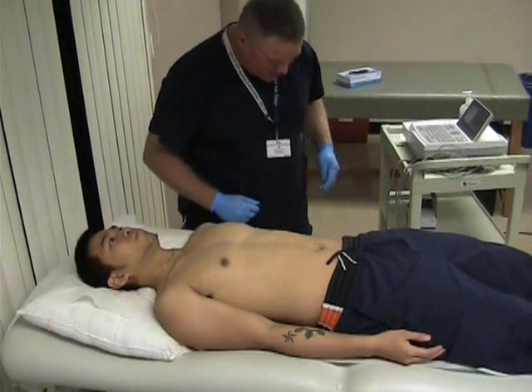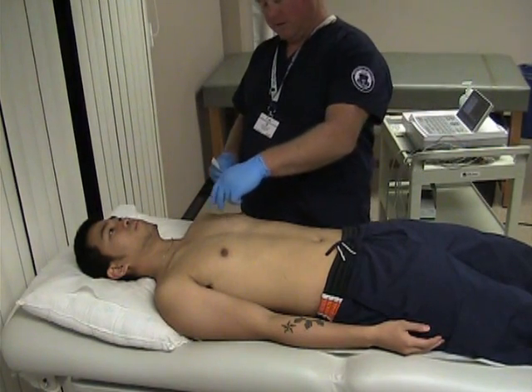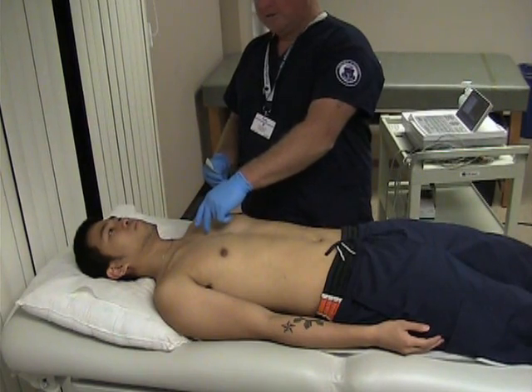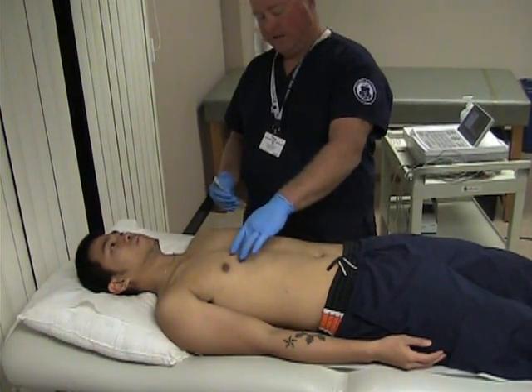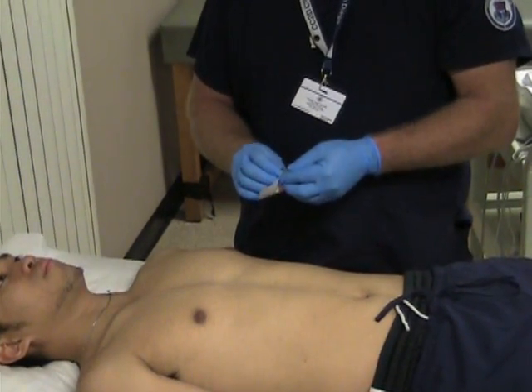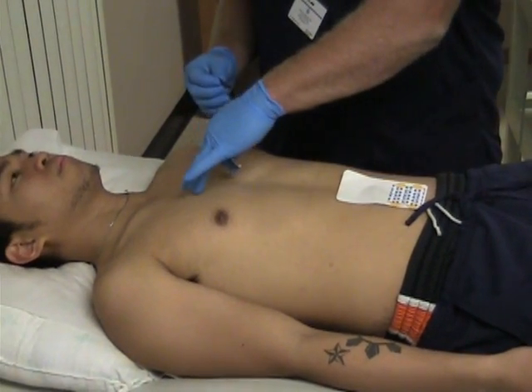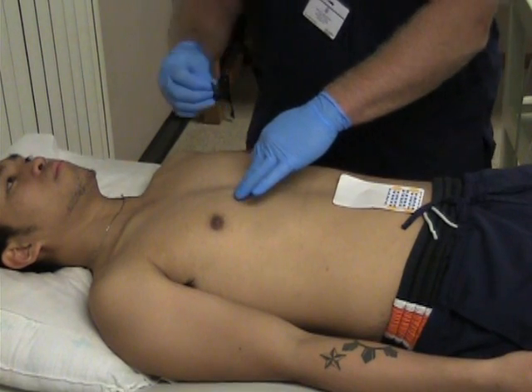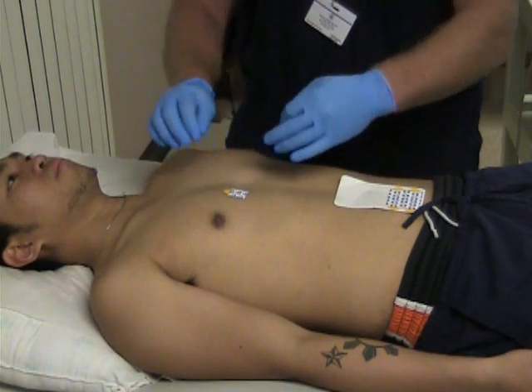We have a male patient. We're going to locate the fourth intercostal space on the right side of the sternum — this will be our V1 lead. We count down the ribs to the fourth intercostal and place our lead to the edge of the sternum.